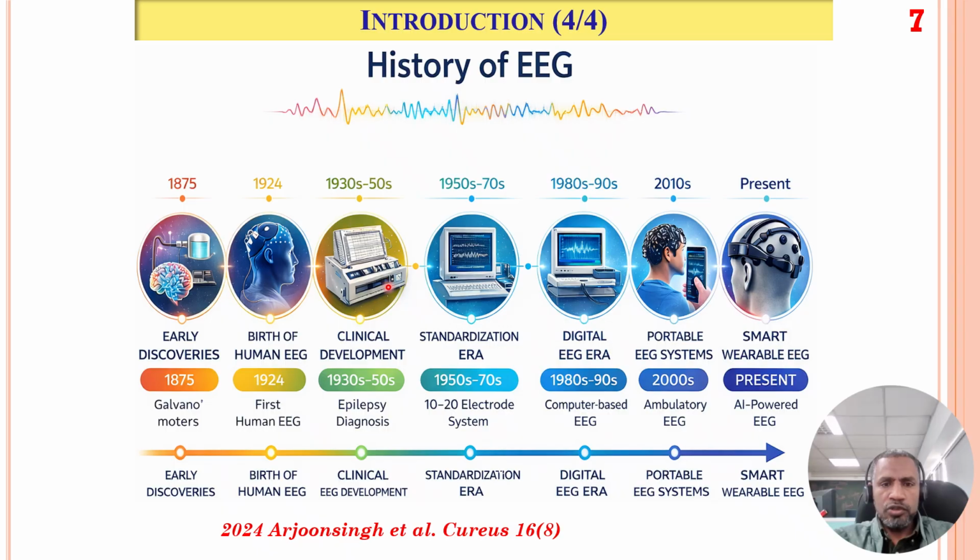It served as clinical development, especially for epilepsy diagnosis. From 1950 up to the 70s, this type of EEG device was more advanced than the previous one.